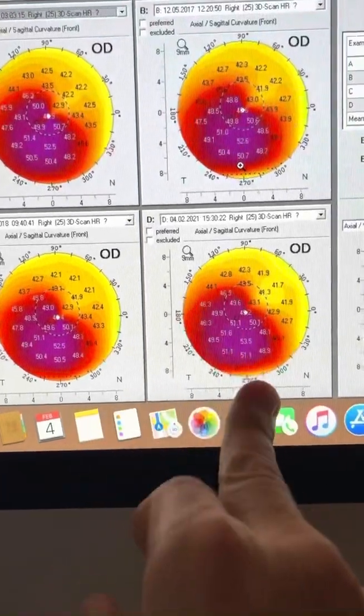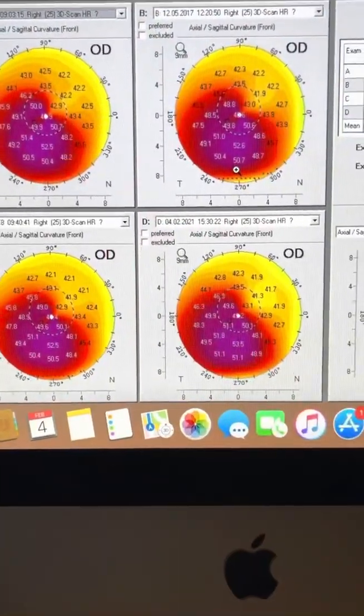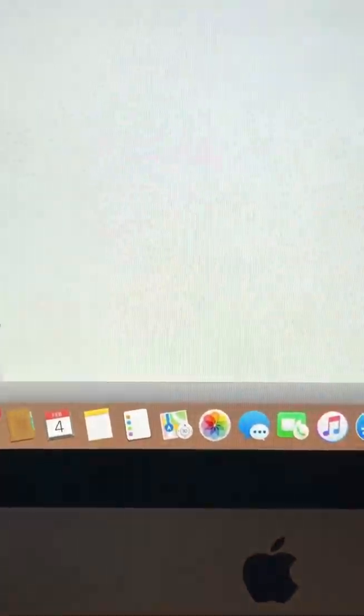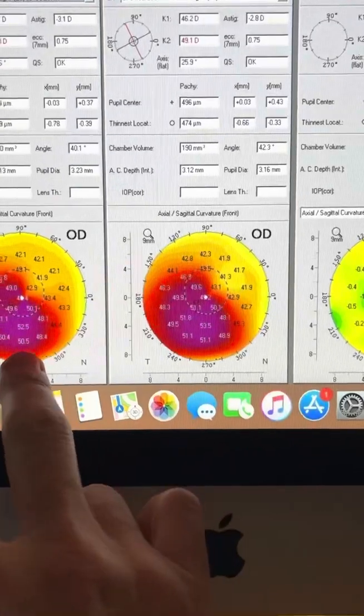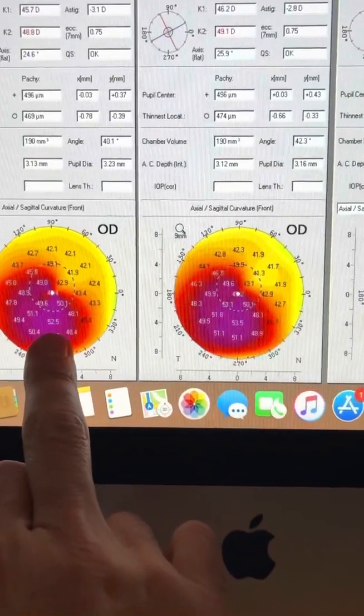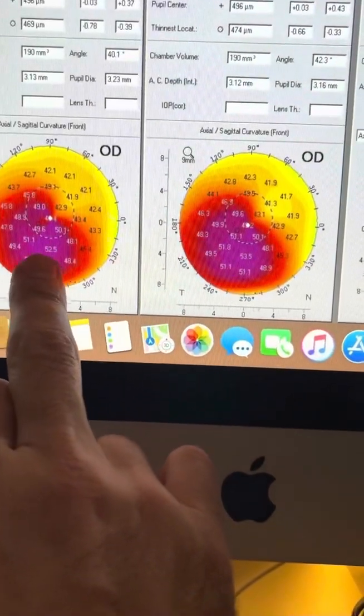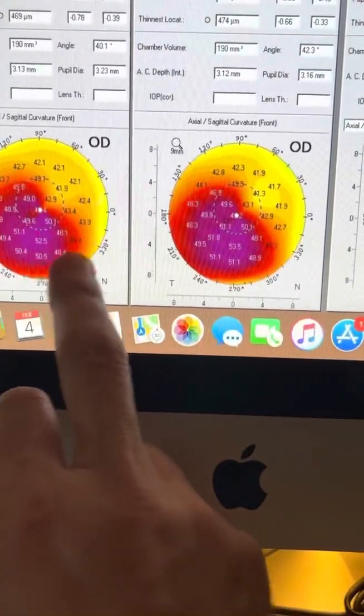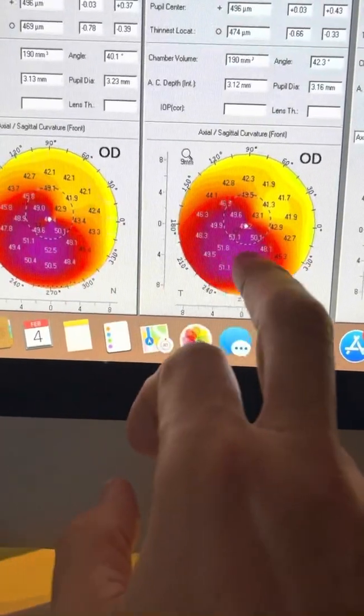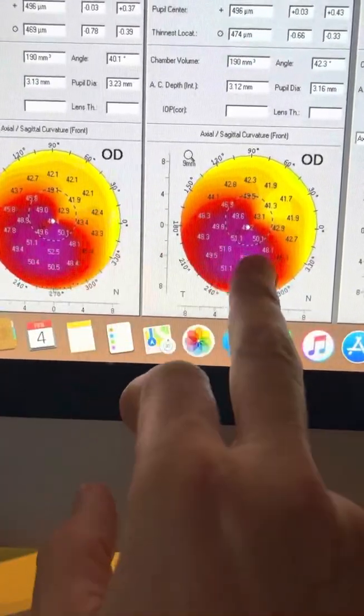So we have a five year, four and a half year follow-up. And if we go to see the actual changes in her right eye since 2018, we can see a one diopter change. She was 52.5, she's 53.5. So a diopter change at the peak of the cone. And the cone looks a little bit worse overall.